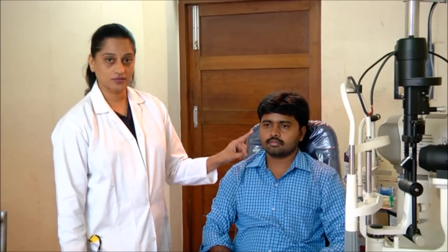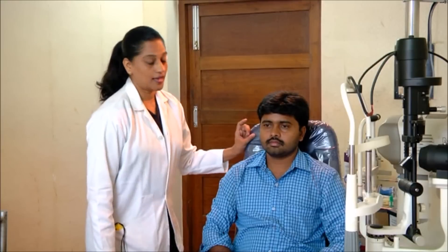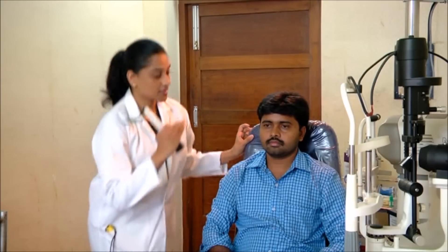Also check for ptosis or proptosis with a cursory examination. If you are too tall, do not hesitate to sit at the level of the patient's eyelids. If you are a short person, make sure you have a comfortable stool or chair and sit at eye level. You should not stand directly in front of the patient — if you do, the patient will not look at the target and you will induce miosis and accommodation, making your inferences incorrect. Always stand to the right side of the patient and bend to his eye level.